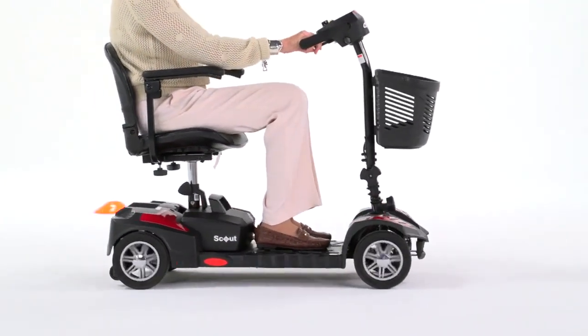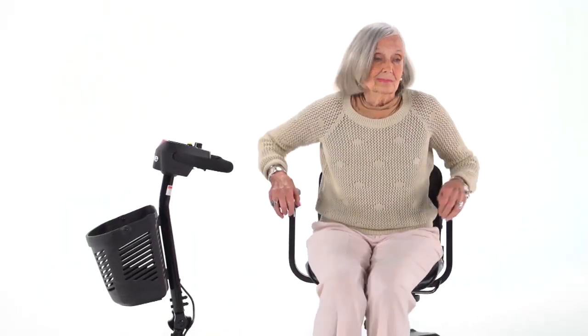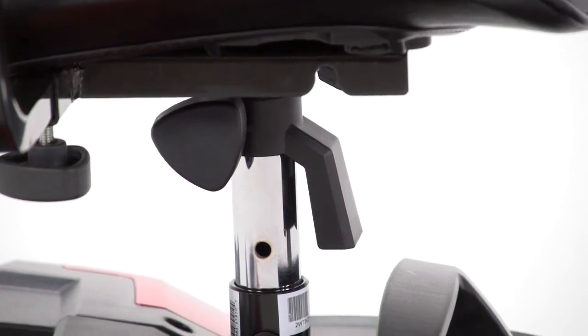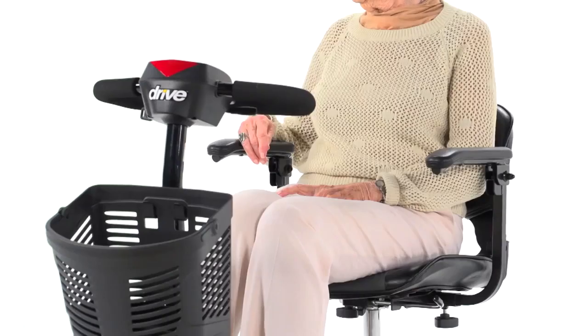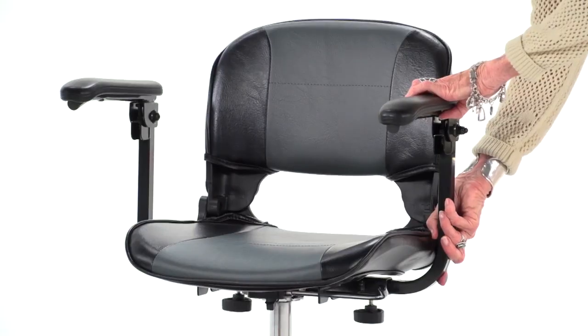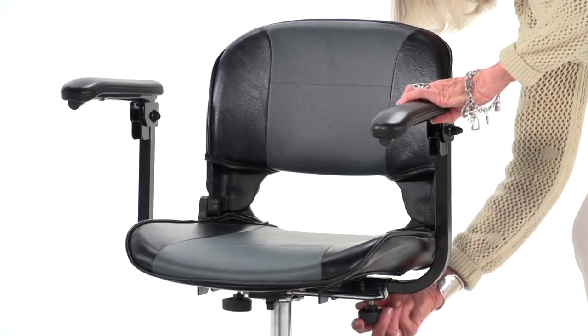Along with great performance and style, the Spitfire Scout Deluxe offers excellent comfort. The upholstered stadium-style seat can swivel 180 degrees and also has three height selections to suit users of nearly any height. The padded armrests flip up for convenient boarding and exiting of the scooter, and the armrest width can be adjusted to best fit the user.